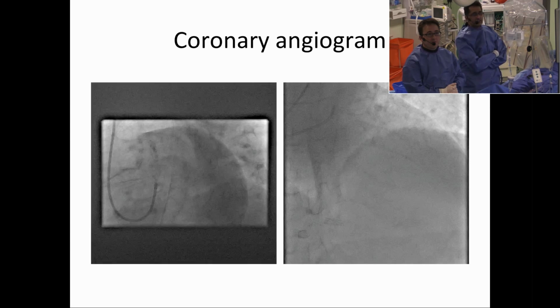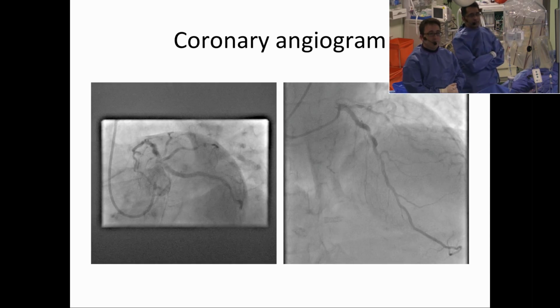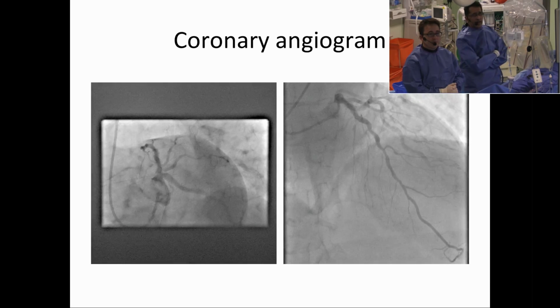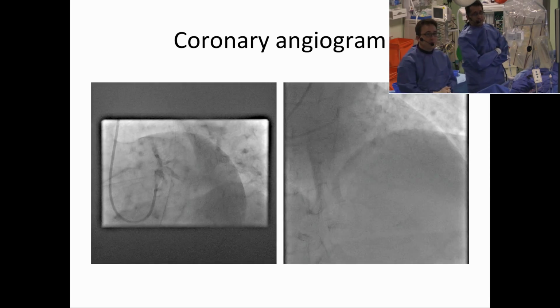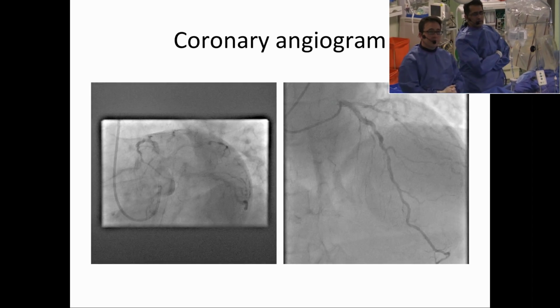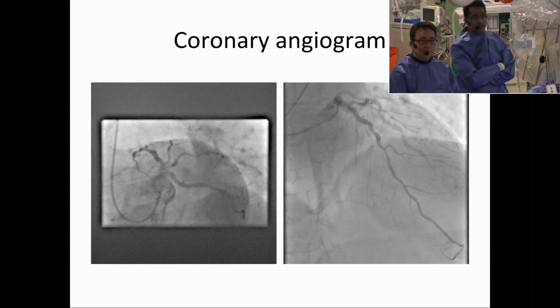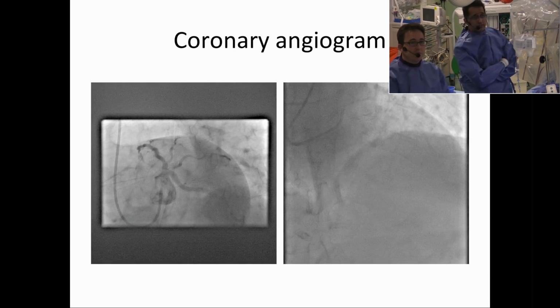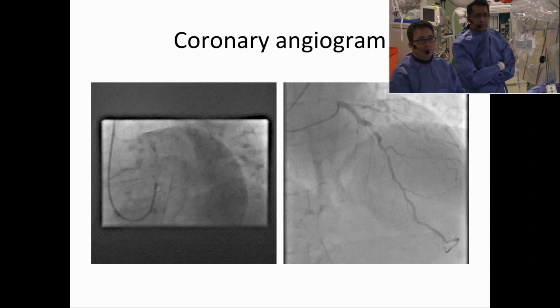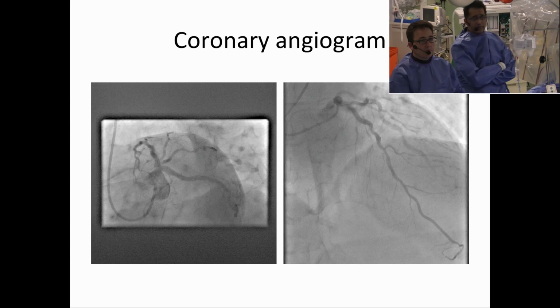Okay, in the spider view, you can see that there may or may not be something at the ostium of the LAD, and it's really quite difficult to image that area. On the right-hand panel, that possible stenosis is not really very evident, but you can see the diffuse pattern of disease in the mid-vessel. Now, it's unclear whether this was given with nitrates. I must say my routine practice is to give nitrates before angiography, but that isn't universally the case, and so this may or may not have been with nitrates, but the mid-vessel certainly looks diffusely diseased, and we want to be considering whether that might be a cause of his symptoms.